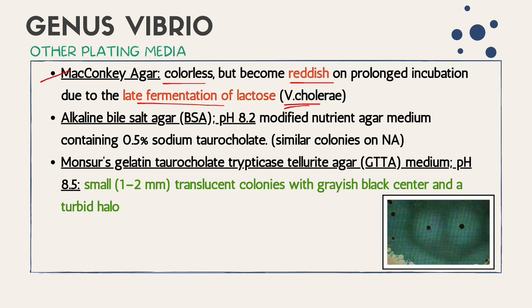But this is quite questionable because this is from another book, okay? In our Surinder Kumar book and in Mahon, Vibrio cholerae was not mentioned to be a lactose fermenter. So for now, we will be considering this information as questionable.